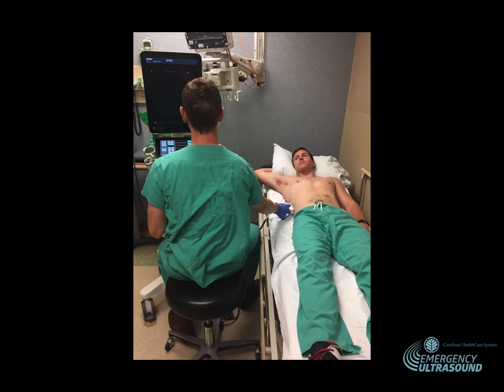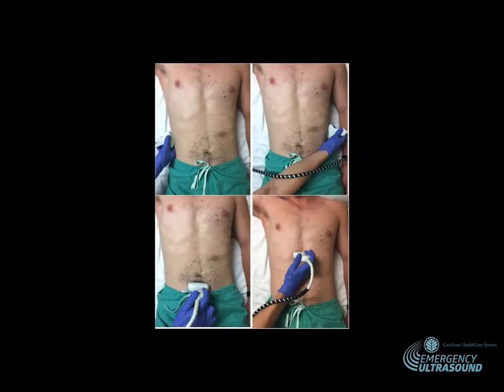Well, first you have the patient lie flat on their back, you wheel the ultrasound machine into their room, and then you use the curvilinear probe. I don't have a really good picture of it right here, but the curvilinear probe is not the phased array that looks like a little square that we use for the heart. It's not the linear because that's a high frequency probe and really only good for superficial structures. So this is that nice rounded one. It's a pretty big probe, but it's really the best for this exam.